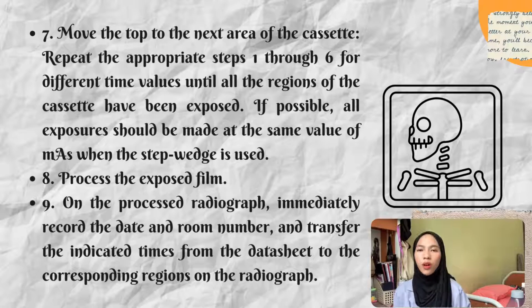Last but not least, on the processed radiograph, immediately record the date and room number and transfer the indicated time from the datasheet to the corresponding regions on the radiograph.